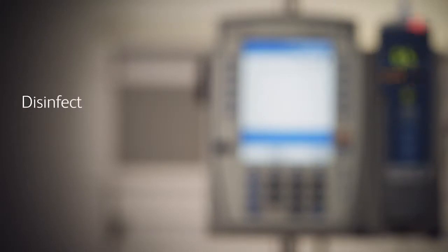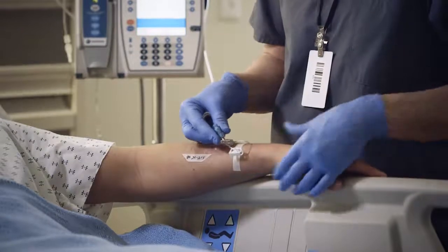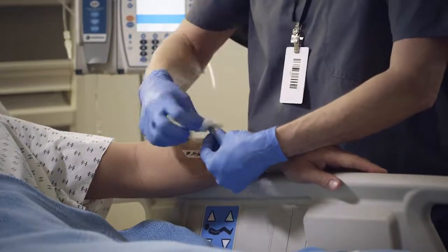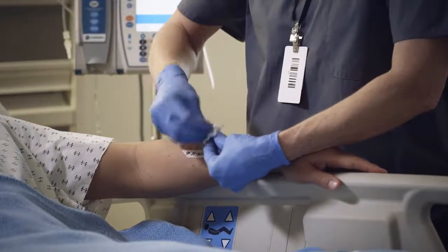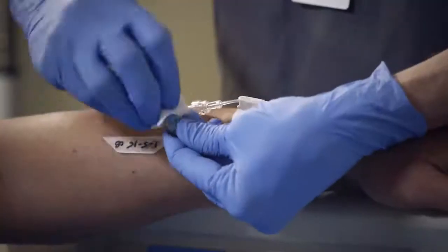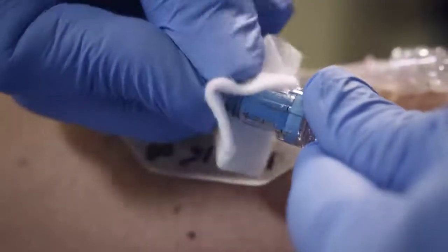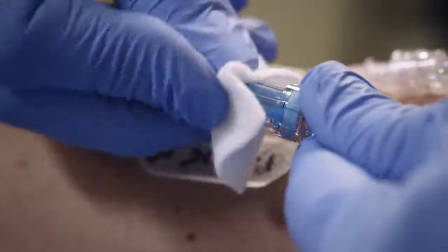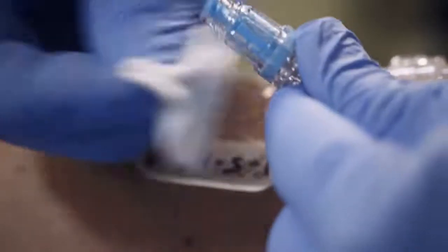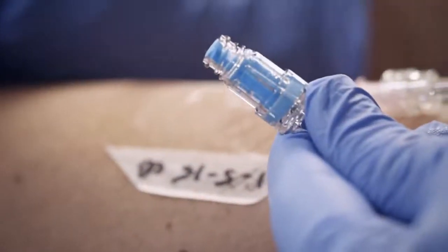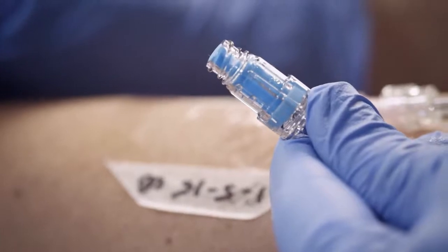Remember to disinfect the needle-free connector before every access per your hospital's protocol. Using friction, scrub the top and threads of the connector with alcohol or other approved antiseptic solution. Let the device dry to complete the disinfection process. Complete drying also allows for an easier disconnection after an infusion is complete.